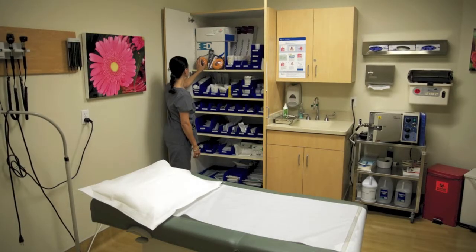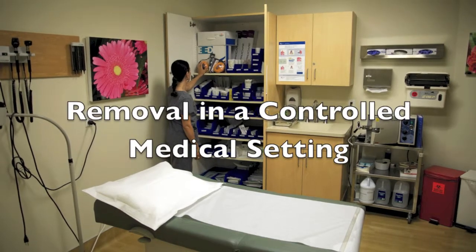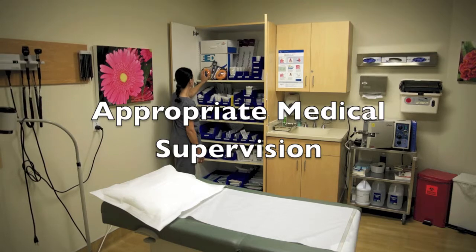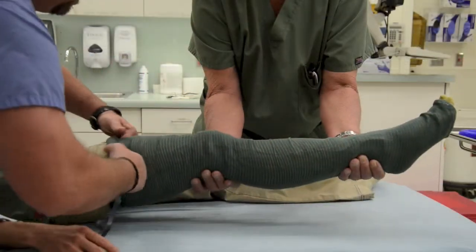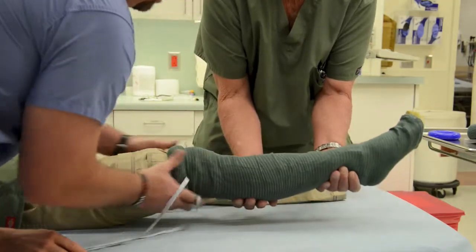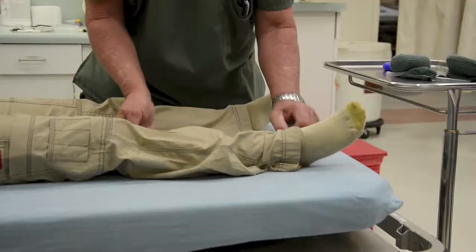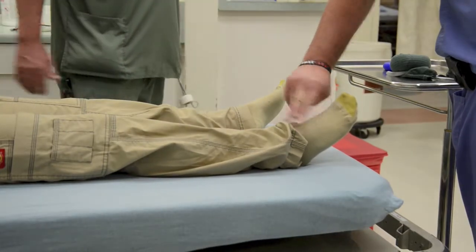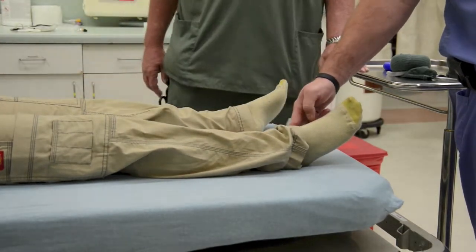How to remove the EED. Once in place, the EED should not be removed until the patient is in a controlled medical setting under appropriate medical supervision. Remove sequentially, first down one thigh, then down the knee, and then down the ankle, all on one leg. In between each step, the patient's blood pressure and clinical status should be assessed.